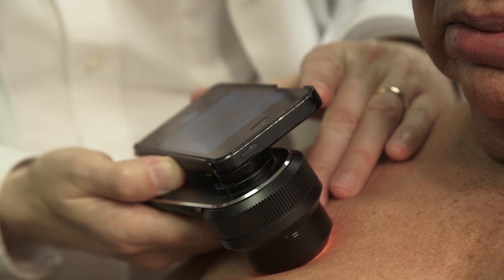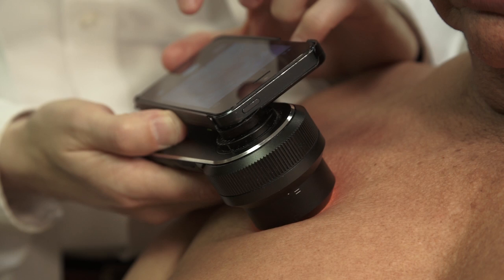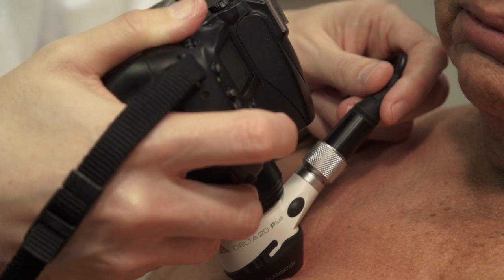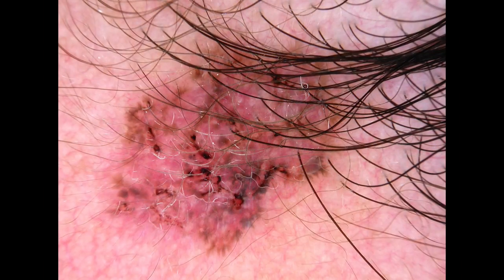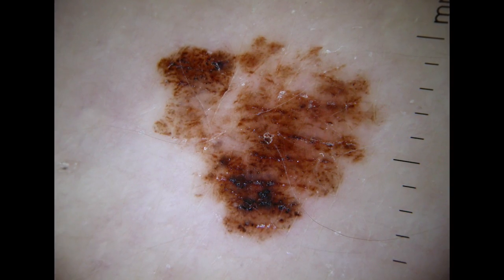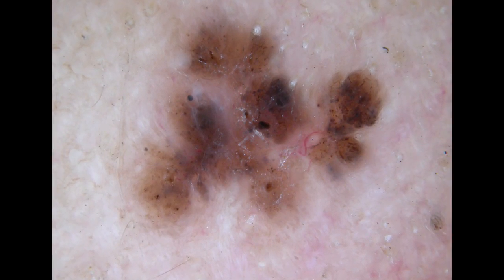Most dermatoscopes magnify the skin tenfold and provide a polarizing light for seeing below the surface. It is very helpful to attach the dermatoscope to a smartphone or a camera to see a larger image on the screen and to capture the image for review during the patient visit and after a biopsy result is available. The most important use of a dermatoscope is to detect skin cancer early and to identify suspicious lesions that are not skin cancer and don't need a biopsy. By increasing the sensitivity and specificity for skin cancer, fewer skin cancers are missed and fewer unnecessary biopsies are performed.